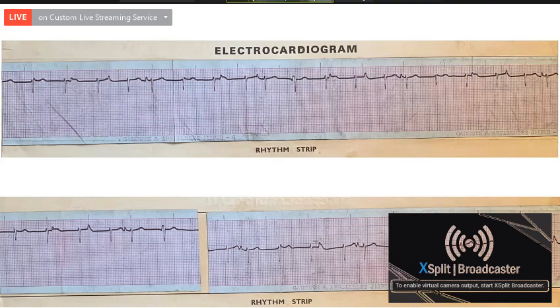So when the rate is more than the standard rate of the junction, but at the same time we cannot qualify it as tachycardia, what term can you apply? Accelerated junctional rate. Very good. Accelerated junctional rhythm with intermittent sinus capture.